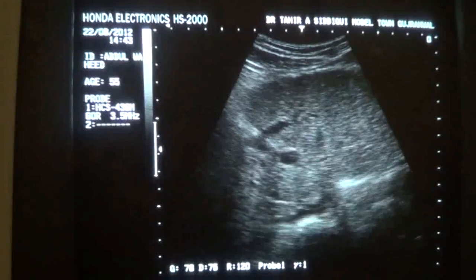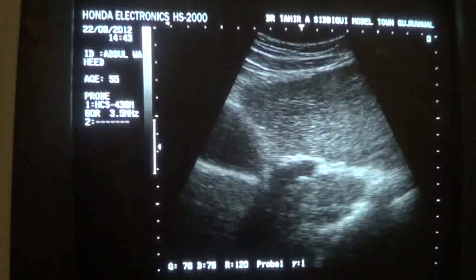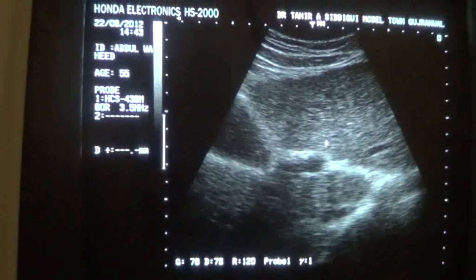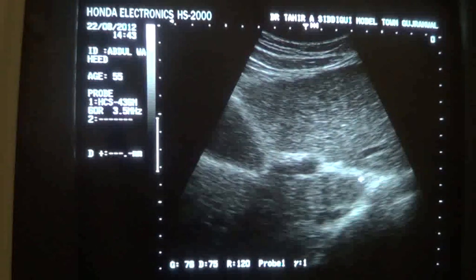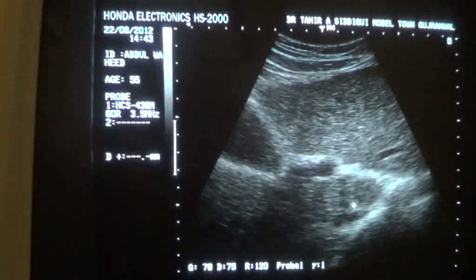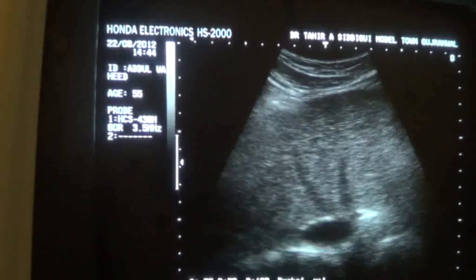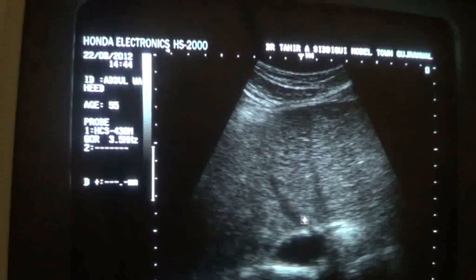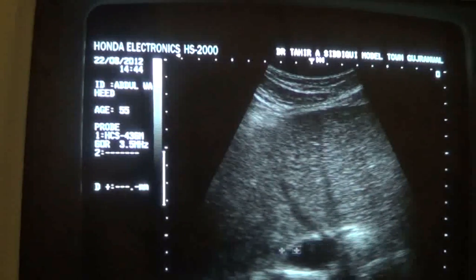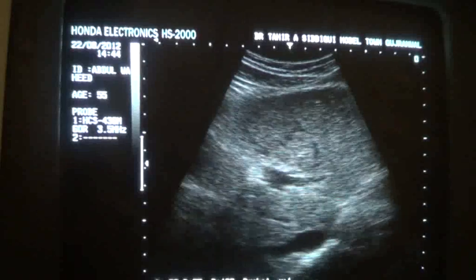This is the transverse section of the left lobe of the liver. You can see the coarseness, the irregularity of the outer surface, diffuse increased parenchymal echogenicity, and coarseness. This is the ligamentum venosum, the IVC, and the caudate lobe — segment one. You can see the blurriness of the hepatic veins. The hepatic veins are not dilated, so there is no question of congestive or cardiac cirrhosis.